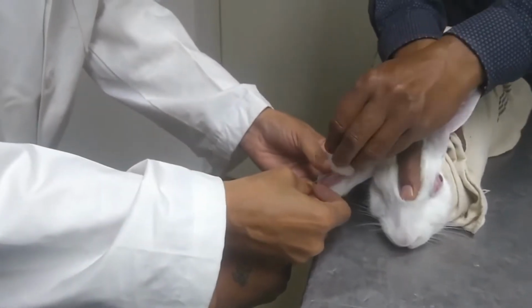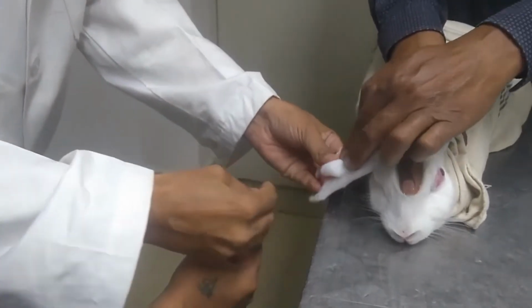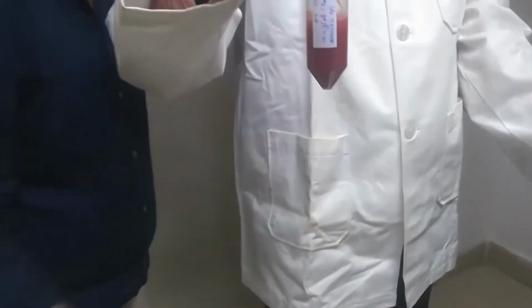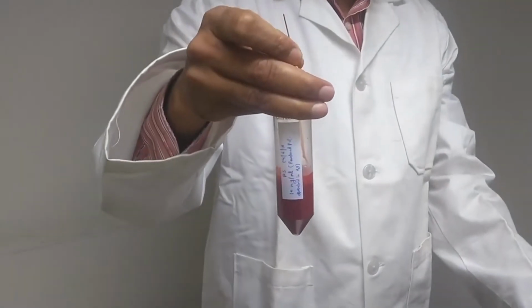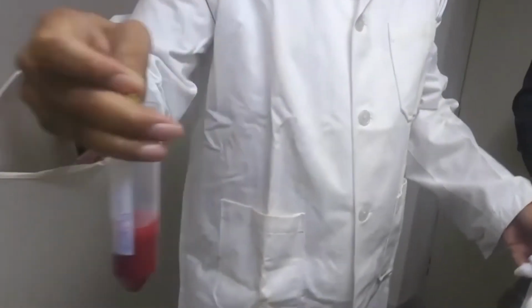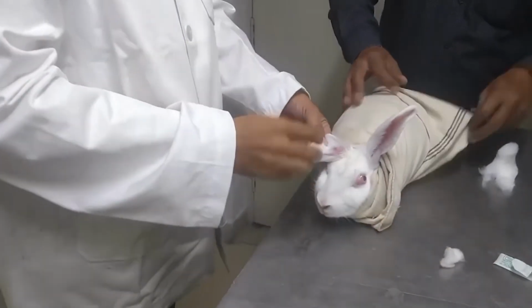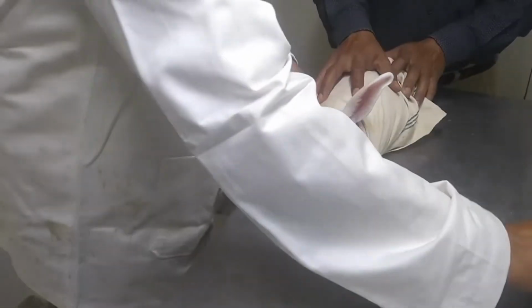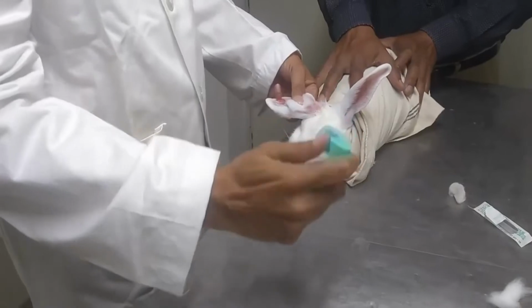Then to stop it, we just press. With less and less pain, you can collect the bleed like this. Now we have to make sure that no further bleeding occurs. Then we will wipe out whatever bleed is outside.